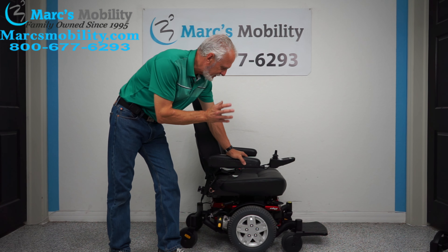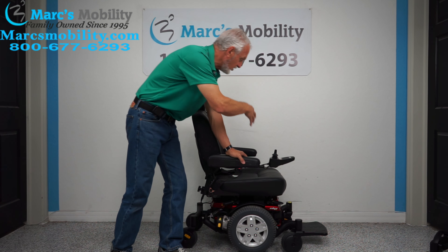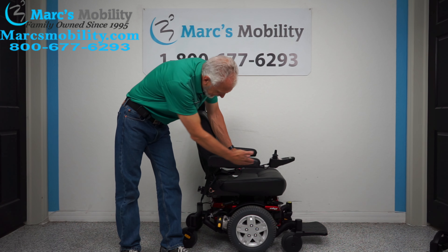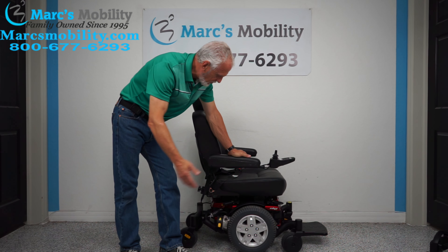This chair was probably used maybe two or three months. There's no meter on here but everything is practically new on it — I'm assuming it was used less than two or three months. There's not even any scratches; there's a little bit here just from the door, but other than that it's in new condition.